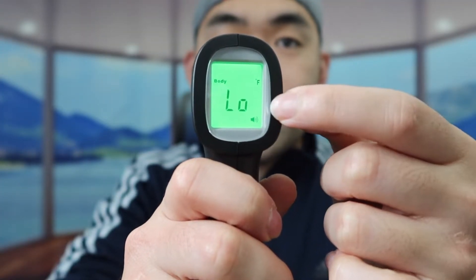You'll probably want to peel off this protective film first if it's the first time using it. But here is basically what the screen looks like — it shows you what mode you're using, whether it's body, Fahrenheit, and so on.